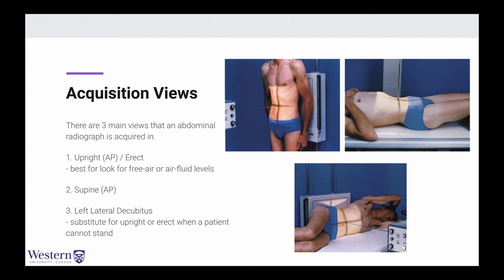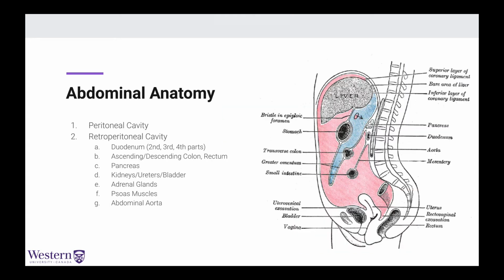Now, those images themselves are actually rather old-fashioned images, but you can see there that we are able to show approximately where the actual X-ray will be taken, as they use a visible light source to plot out both the center point of where the X-ray is being exposed, and also plot out which quadrants, and make sure that we image everything relevant within the abdomen.